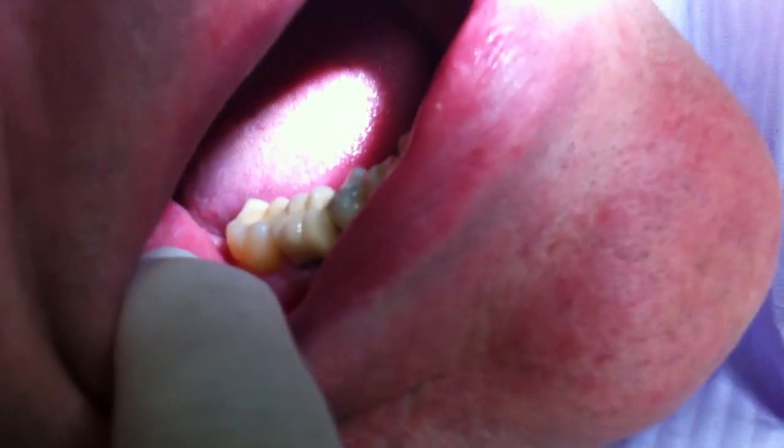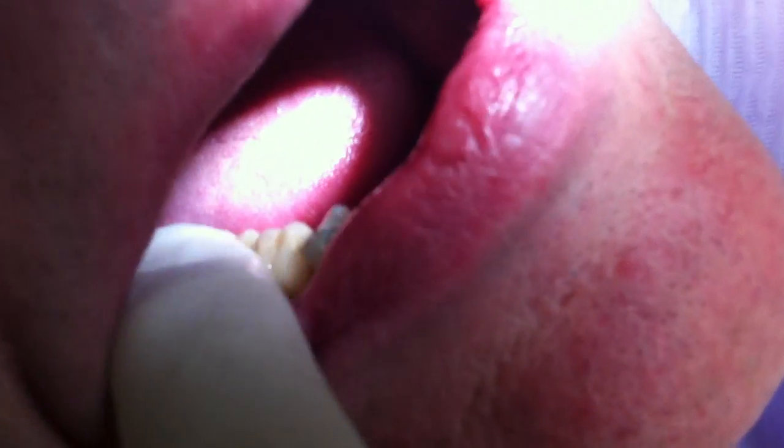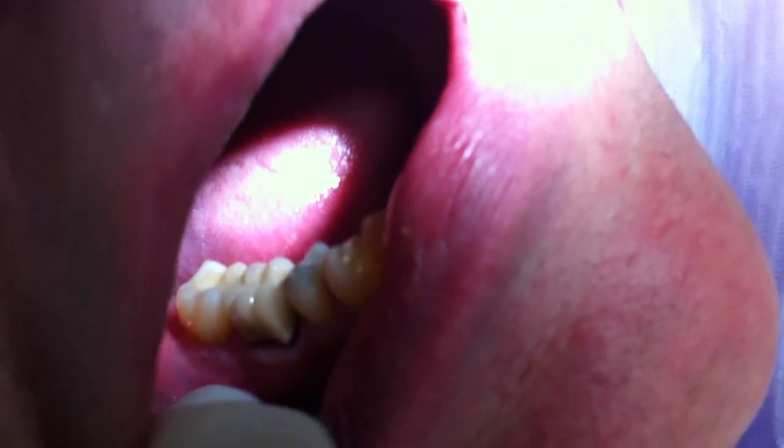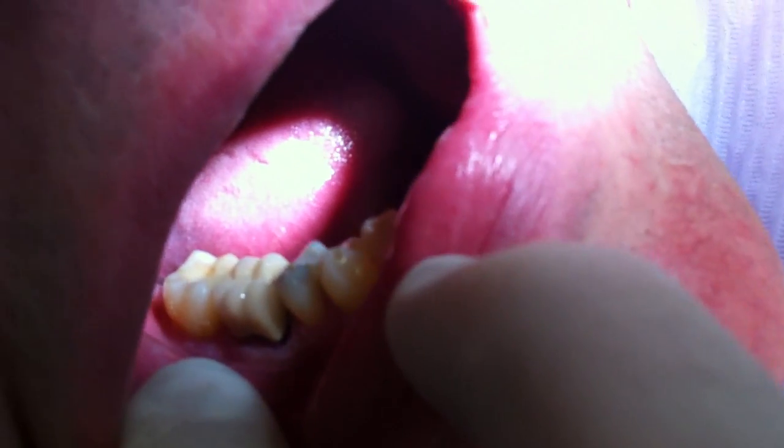Perfect. These cases generally go very well when we have a very cooperative patient. You might think it's just a model, but we do have a live patient here. Thank you very much — I think this is a success. Now we just need to put some glue on and we're done.